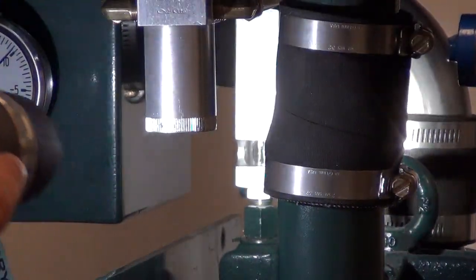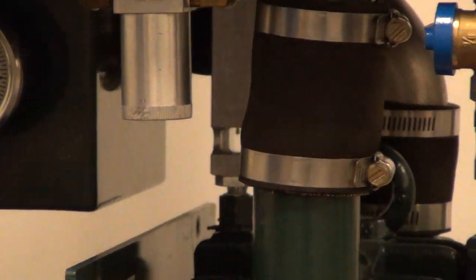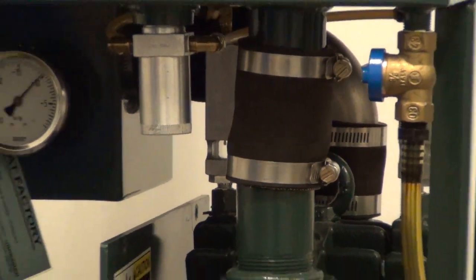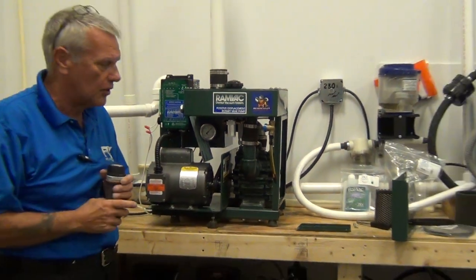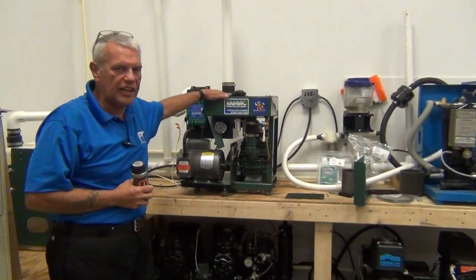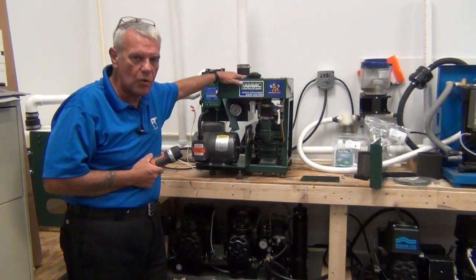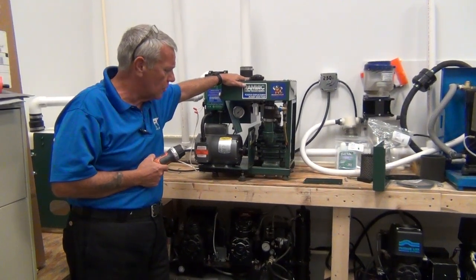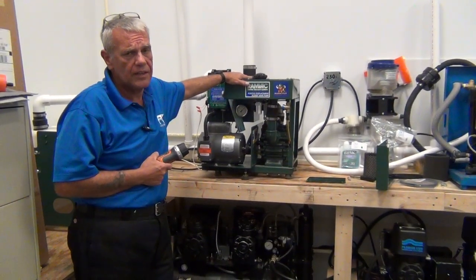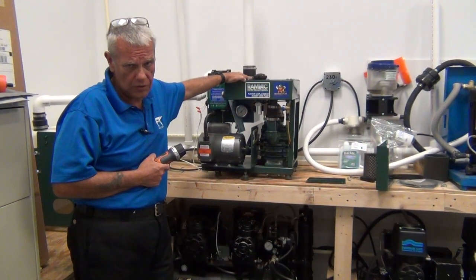Now, while the pump's running, be very quiet and observe it. Listen to the pump — listen for clicks, bumps, pings, anything that sounds weird on the pump. You usually won't find any problems with these. These pumps are very, very hard pumps as long as they're maintained correctly.